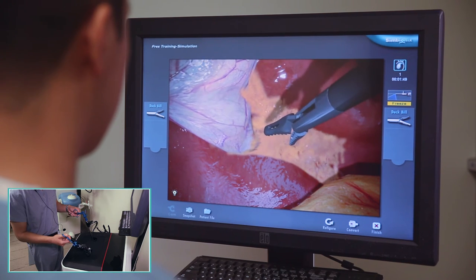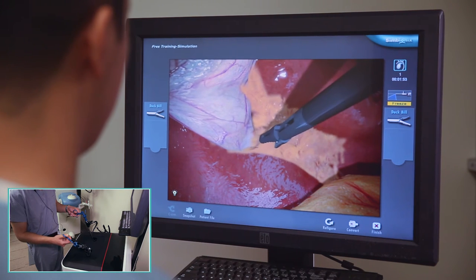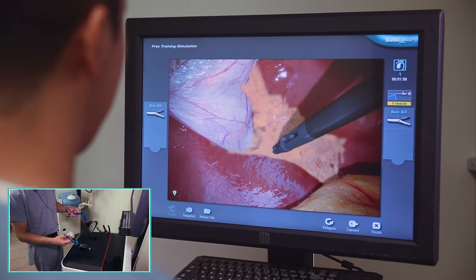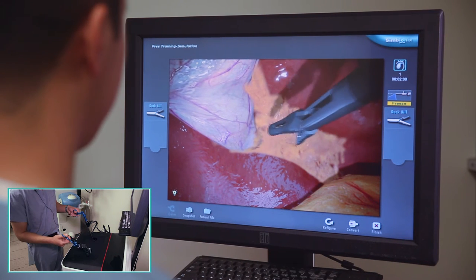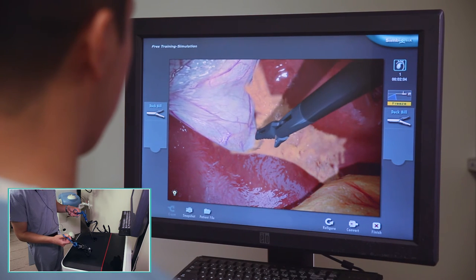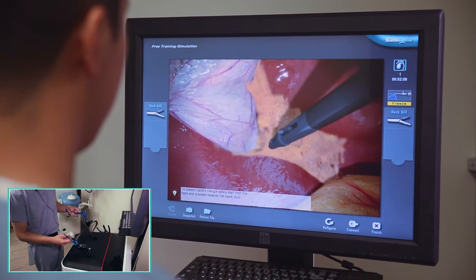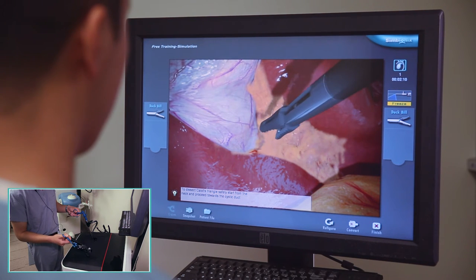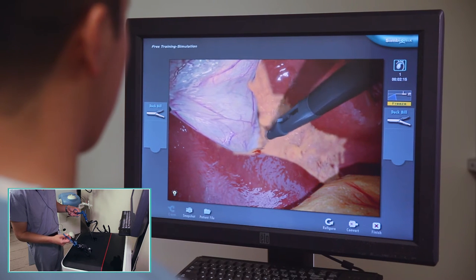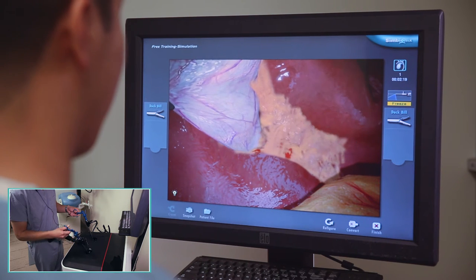The nice thing about the cystic duct is that it is a large, relatively muscular structure, so you can actually come down right on top of it and start to peel off some of the adhesions if you take a superficial enough bite. This is important in the OR, especially because when you place your clips, you want the least amount of tissue between your clips and the duct. So the important thing is that you want to have your duct be as clean as possible so that your clips don't have to do a lot of work.